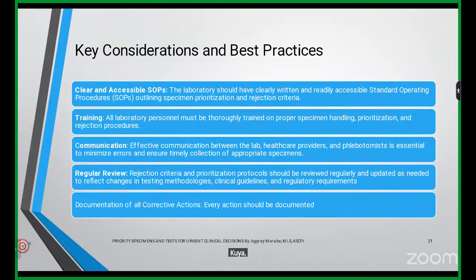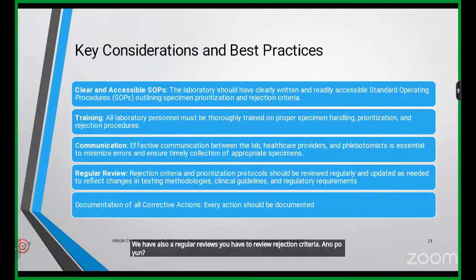We have also regular reviews. You have to review rejection criteria and prioritization protocols. And this has to be updated regularly as need be to reflect the changes in testing methodologies, clinical guidelines, and regulatory requirements. Yes, so your protocols and SOPs are not cast in stone.